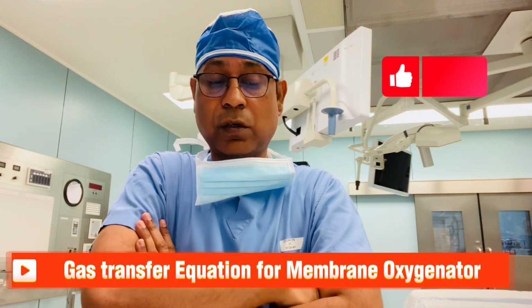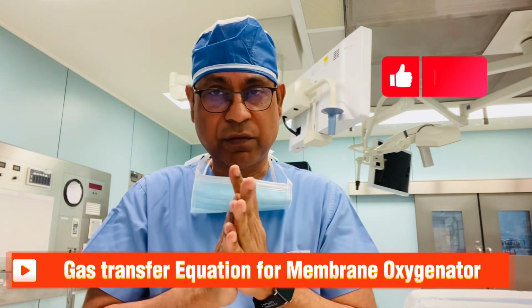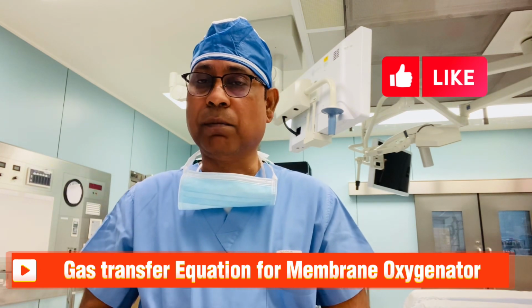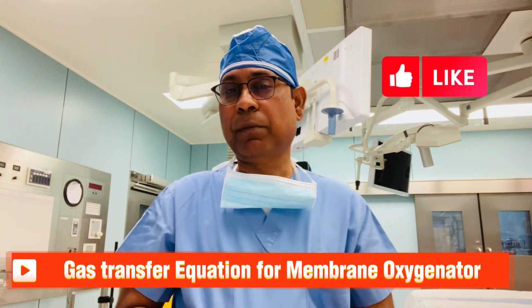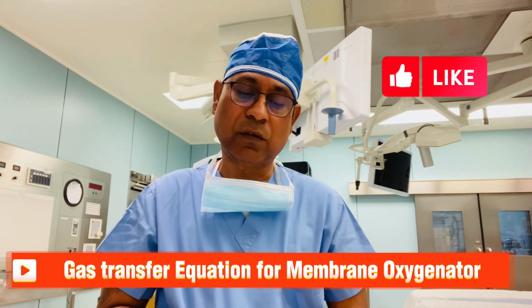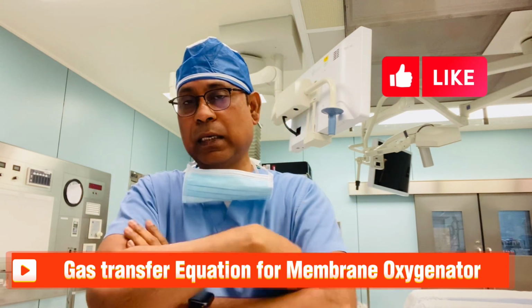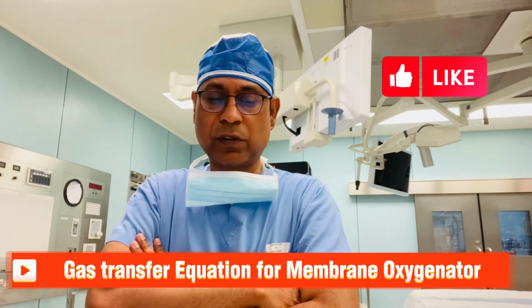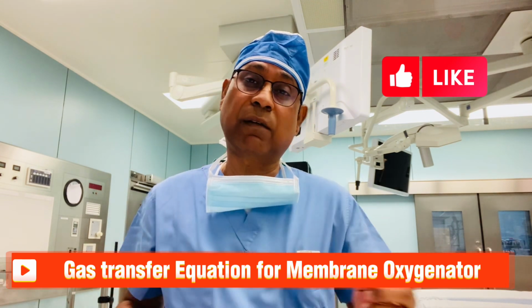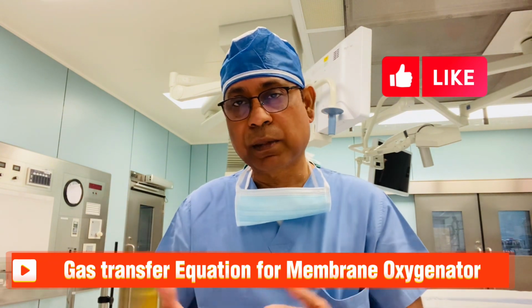Today, we're going to talk about the efficiency of the membrane oxygenator, especially when it is used for long-term bypass, meaning extracorporeal membrane oxygenators. Once we use the membrane oxygenator for cases like ECMO, or extracorporeal membrane oxygenation, it is not for 8 hours. It can run for a couple of weeks, or sometimes a couple of months.